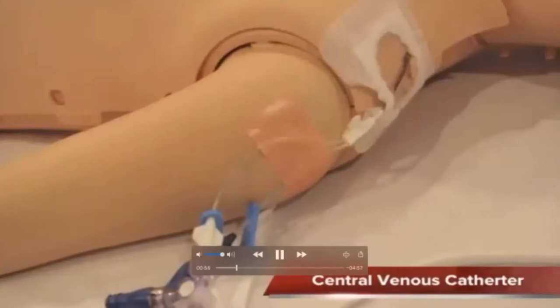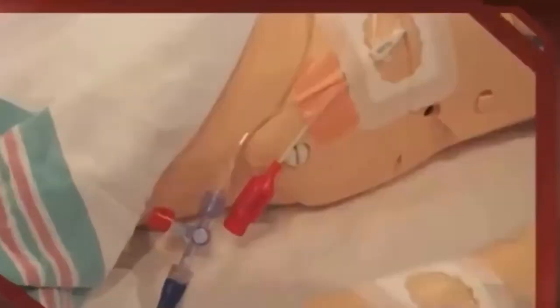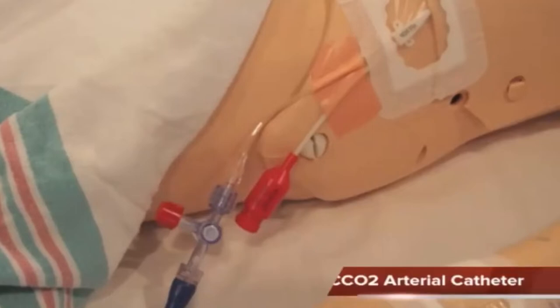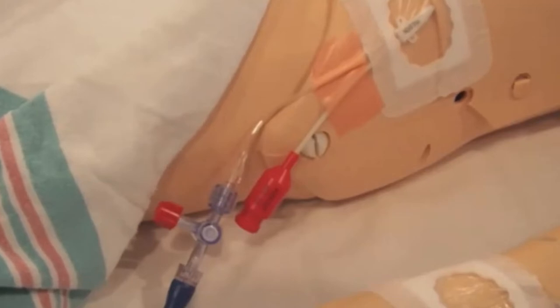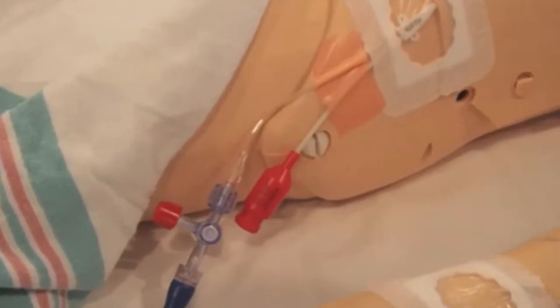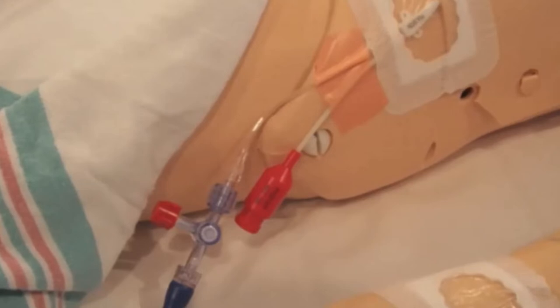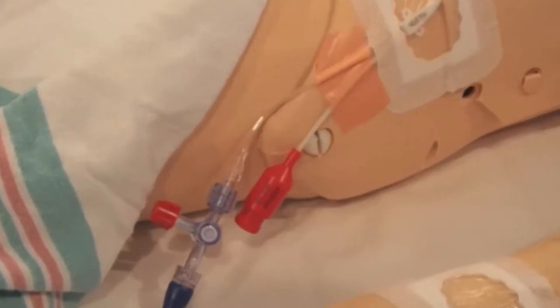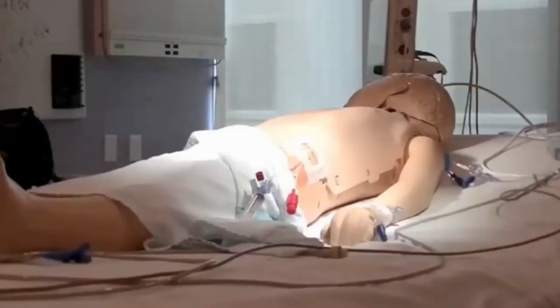The central venous catheter that will be used is a standard central venous line. However, the arterial line catheter that needs to be placed is a PiCCO arterial catheter shown here. If the patient has an existing arterial catheter, it needs to be replaced by a physician using a PiCCO arterial catheter. For children, 3 French 7 centimeter and 4 French 16 centimeter PiCCO arterial catheters can be used, with femoral and axillary artery as preferable sites. The procedure in assisting the physician in placing these catheters, a central venous line and a PiCCO arterial catheter, is dependent on your own facility's protocol.